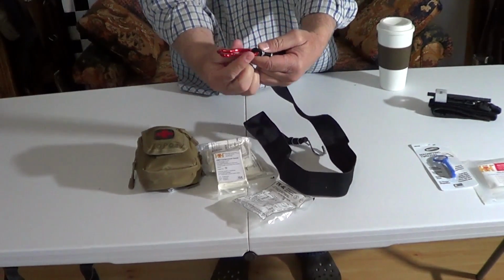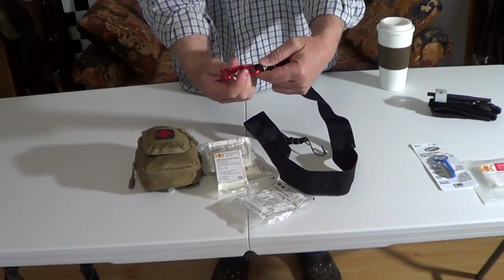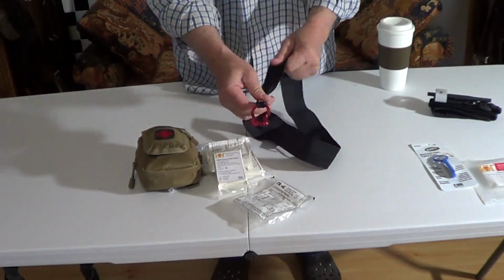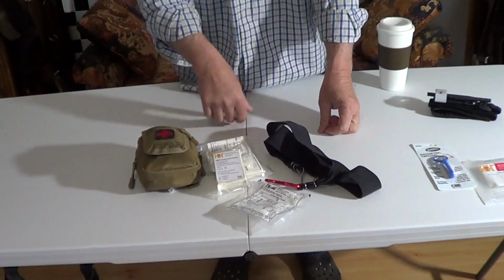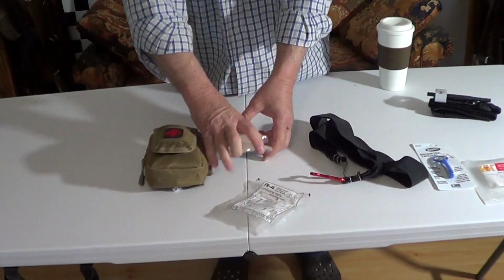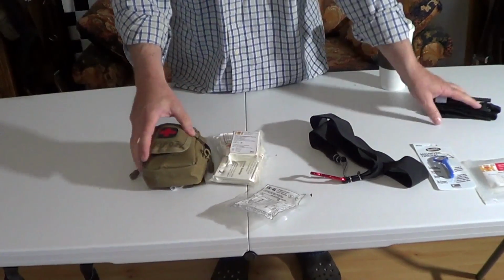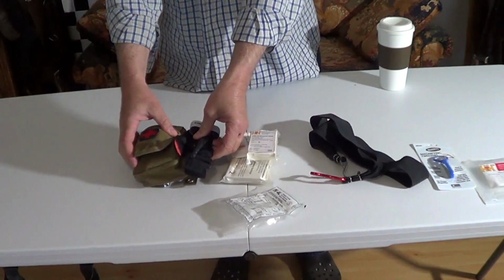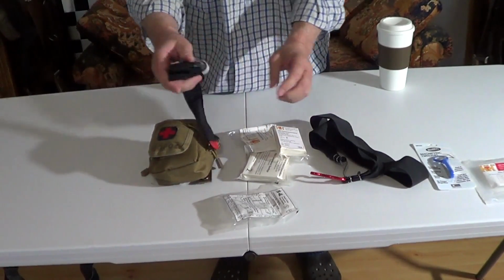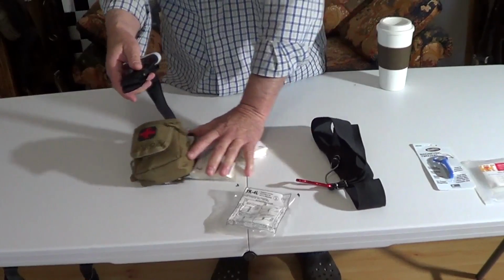Then it's got some cheapy, some sort of tie-off. Look, somebody may say this is a great tourniquet. I think it's a piece of junk. But, hey, I'm just giving you my opinion. This fits in here a little bit looser, and I think I'm going to be able to fit a good tourniquet in here. If not, I'll hook it on the outside. So this is the crap tourniquet.